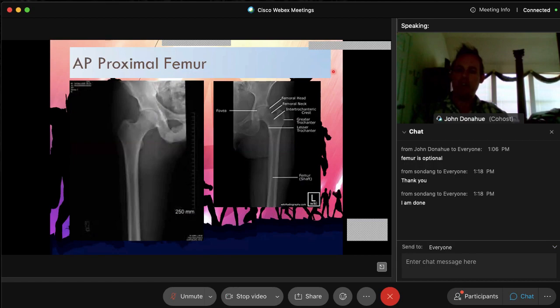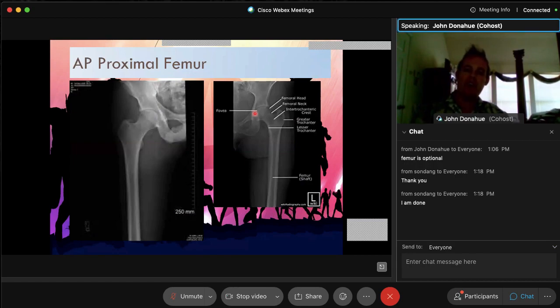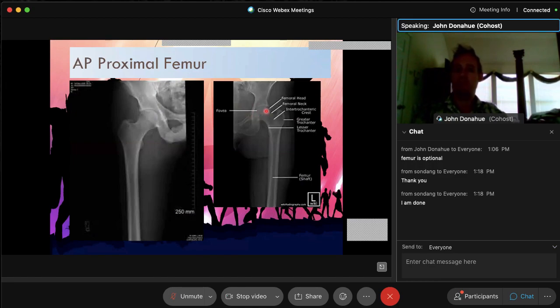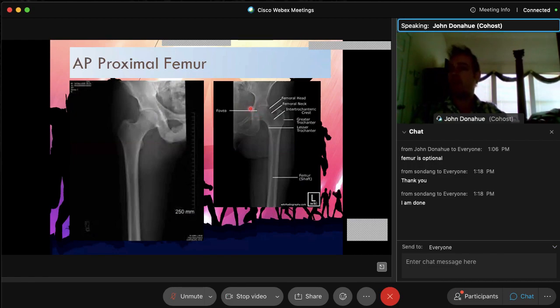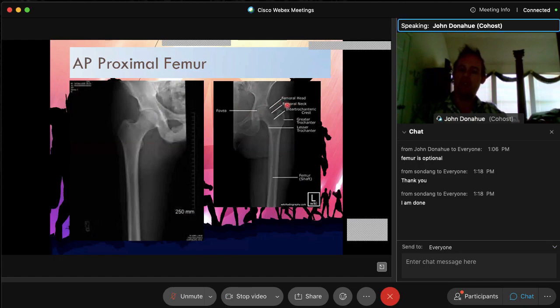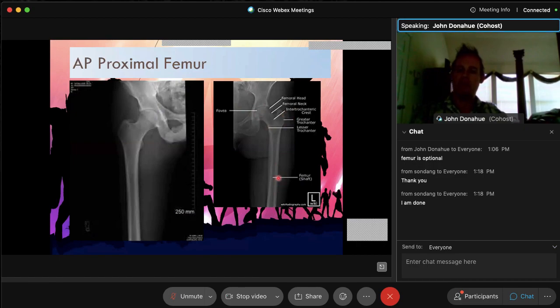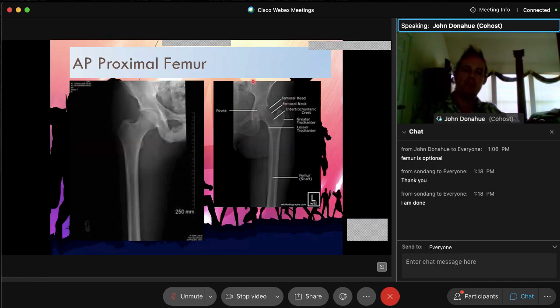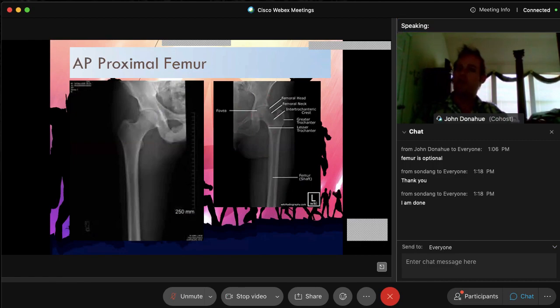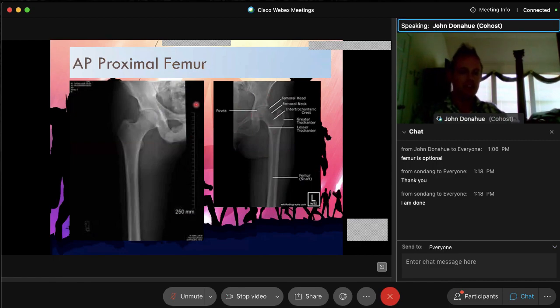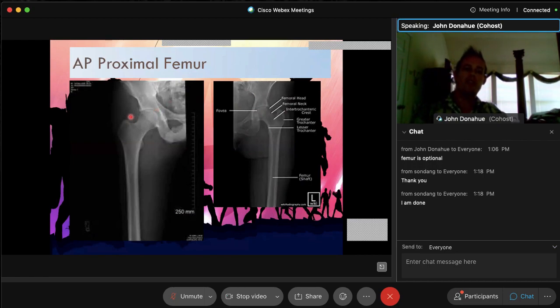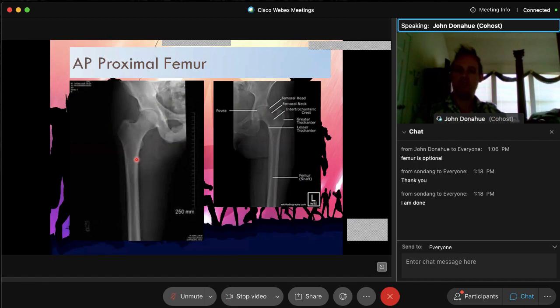And that's what your AP proximal femur would look like. A little bit of the anatomy, we've went over, doing that fovea capitis. I'm sorry, that image is a little blurry. Trying to find more HD image of this exact one here. This is a case of where that patient was positioned properly. They used good exposure techniques. And you can actually view the fovea capitis on the X-ray. I know you can't see that because it's kind of blurry. But, of course, we have all this other wonderful anatomy. We have our femoral head, femoral neck, intertrochanteric crest going down the middle here. We have our greater trochanter, lesser trochanter, and our femoral shaft. Do keep in mind, if I give you a femur X-ray, we've got all this anatomy that we can identify as well. There is a lot of overlap between those exams. Do remember, if we're looking at an AP view, predominantly that greater trochanter is visualized in profile, with the lesser trochanter almost completely hidden on our AP views.